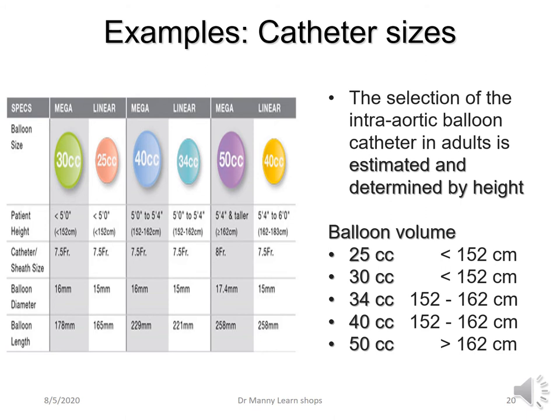You've got lots of different catheter sizes. I'm not purporting any specific manufacturer, whether it's with the pump or the catheter. That's not the purpose of this lecture. It's just to introduce you to the concepts and keep it relatively simple.